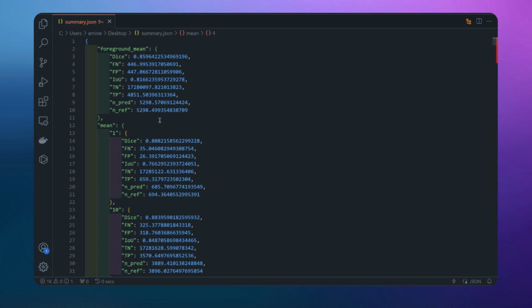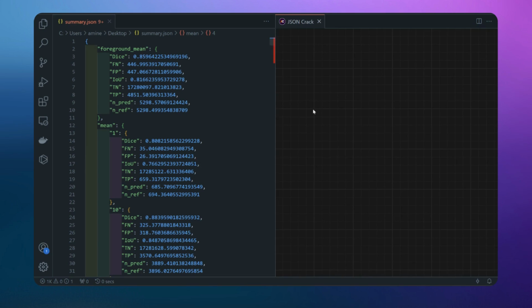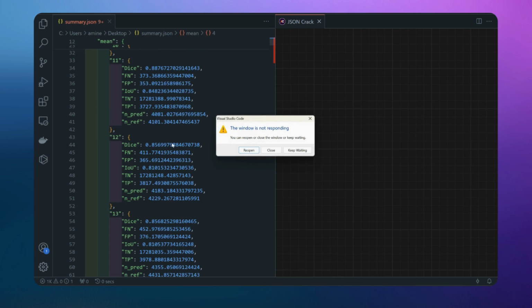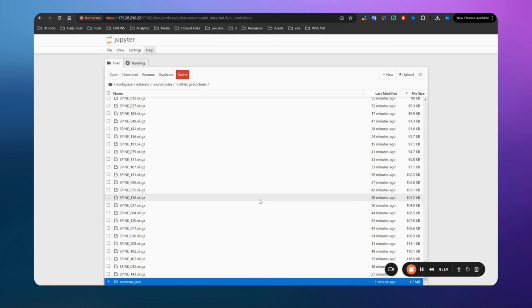And yeah, I think now we are at the end of the video. We will have just the last section, which will be kind of a demo where we use the models that we have trained in this course. It will be a small demo that shows you where you can deploy your models, but we will not deploy the models in real time.